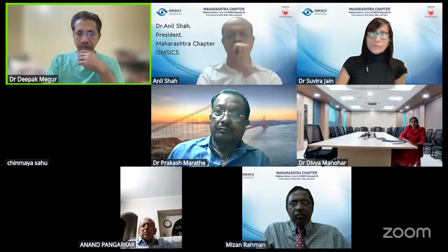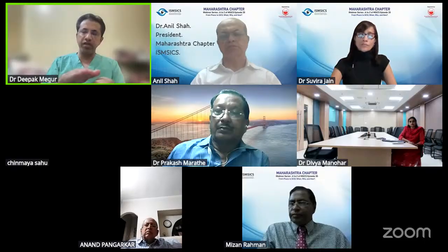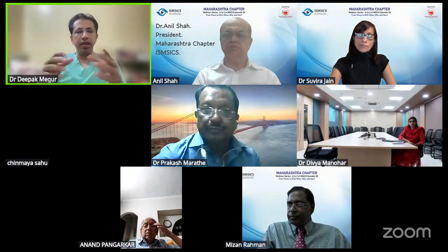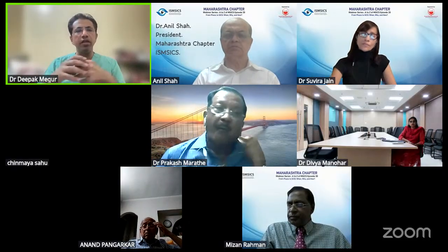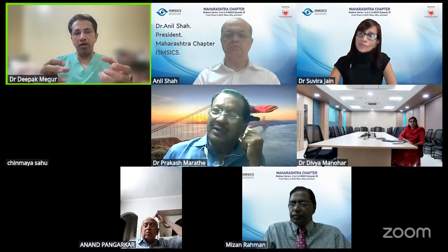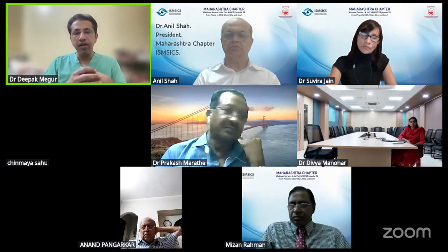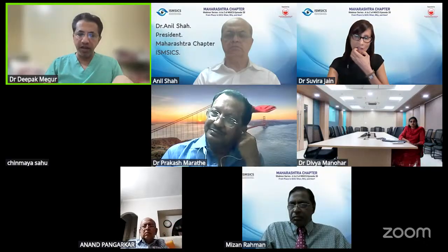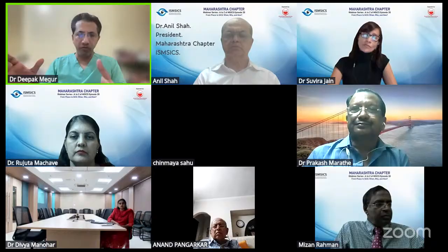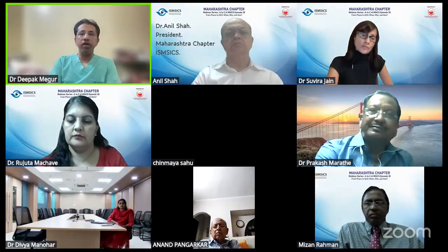Just a few remarks here. So there are situations where you're forced to extend the clear corneal incision, like the case which Dr. Suvira was just showing, that in desperation, when the nucleus is dropping down and you don't have enough time to even convert to SICS, to scleral tunnel. Maybe you're justified in just extending the incision, but I would do it only when we're dealing with smaller fragments, not a large fragment. You can just enlarge and then under the cover of viscoelastic just express them out.